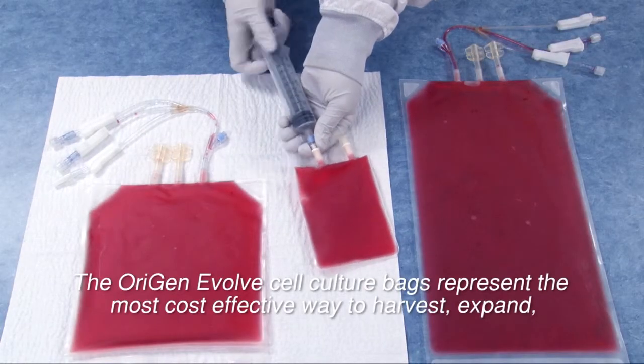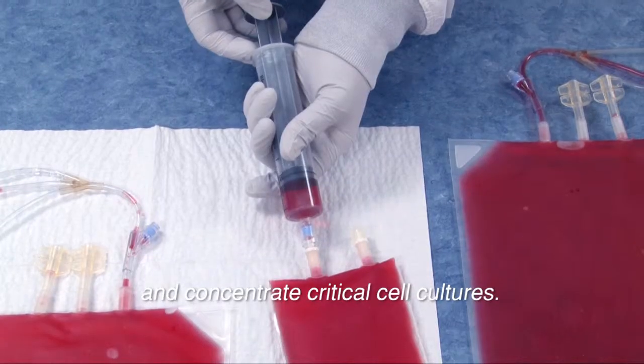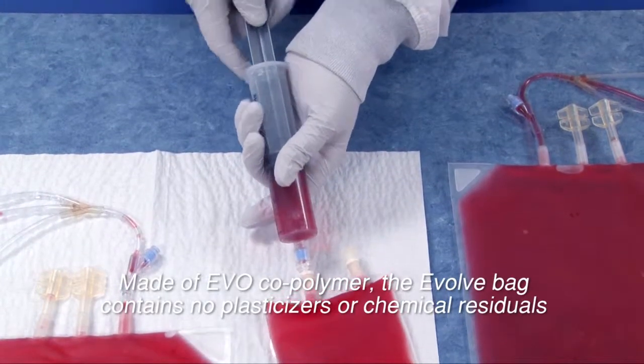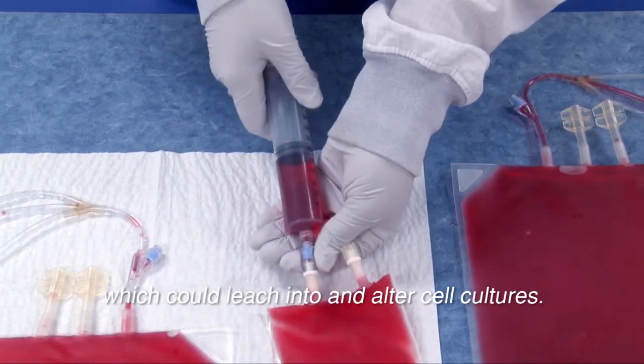The OriGen Evolve cell culture bags represent the most cost-effective way to harvest, expand, and concentrate critical cell cultures. Made of EVO copolymer, the Evolve bag contains no plasticizers or chemical residuals which could leach into and alter cell cultures.